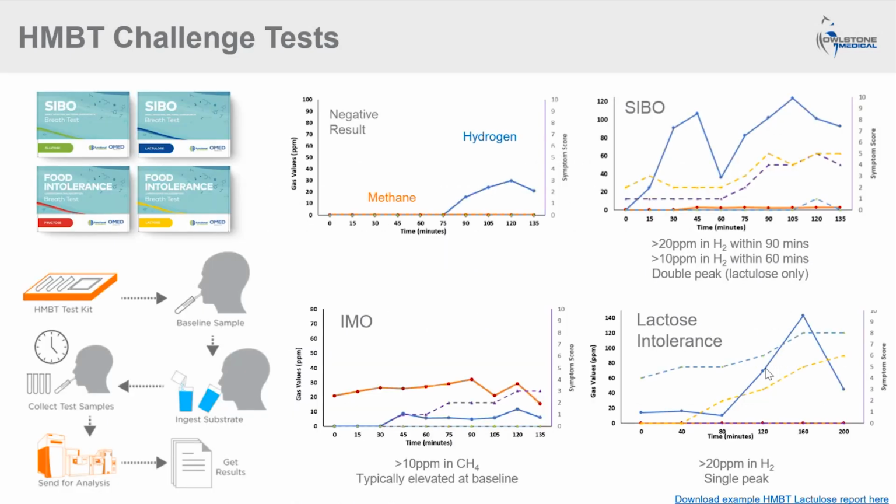They've been extensively used in clinical practice and in research over the last 30 odd years, and the methodology is very well characterized. These HMBT tests provide a very practical way of studying a person's microbiome in a very standardized way. They reduce external factors to a minimum through general requirements such as controlling the diet the night before, fasting, restriction on the use of antibiotics, probiotics, restrictions on exercise, among other restrictions. And they allow collection of breath samples at multiple time points in a very standardized way to explore how hydrogen and methane change in response to a substrate challenge.